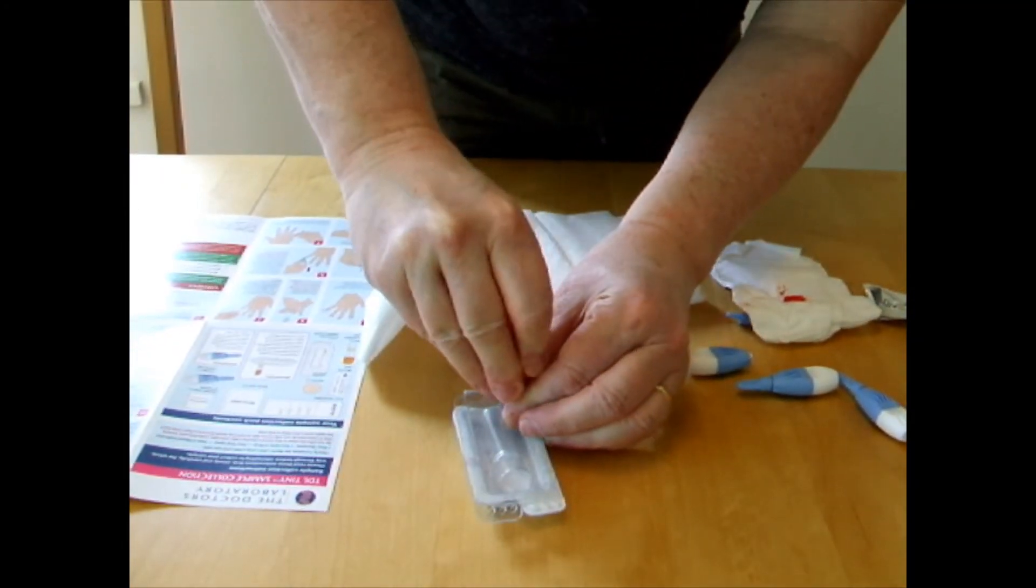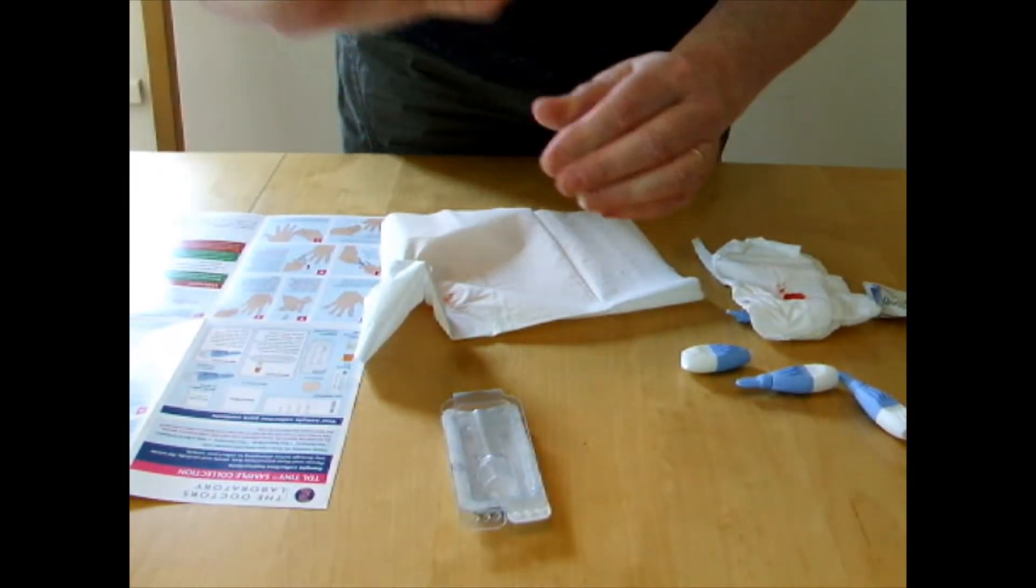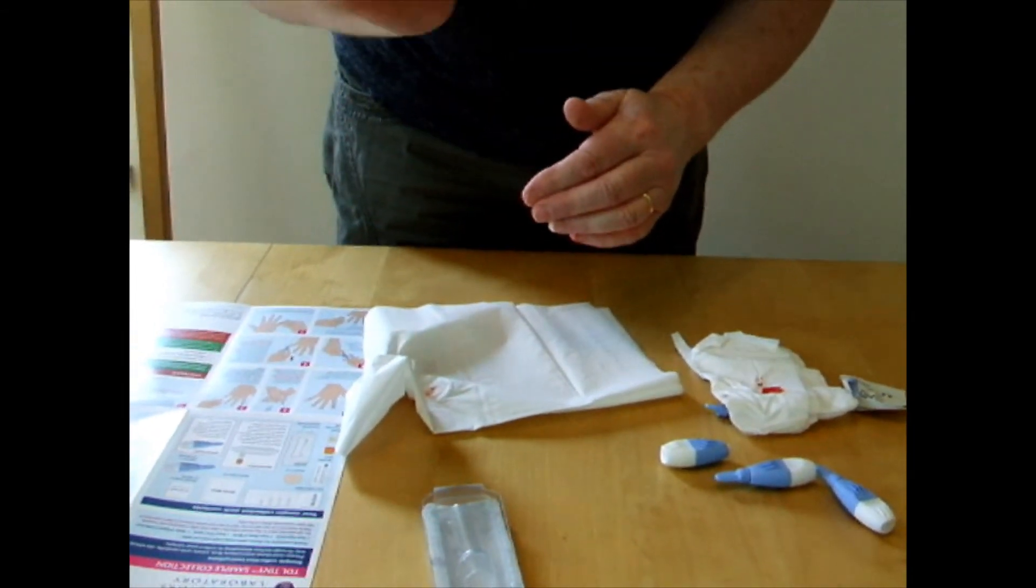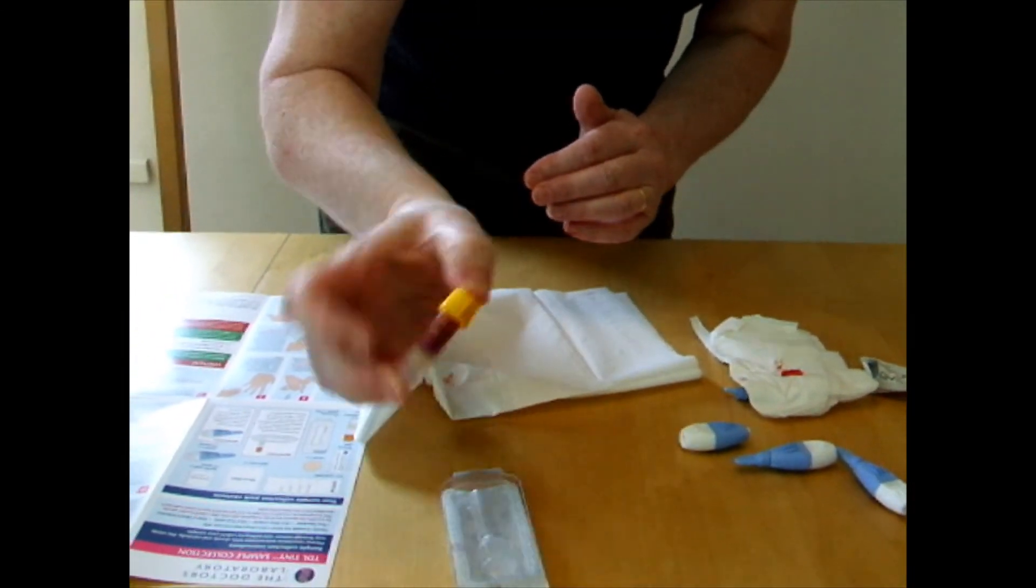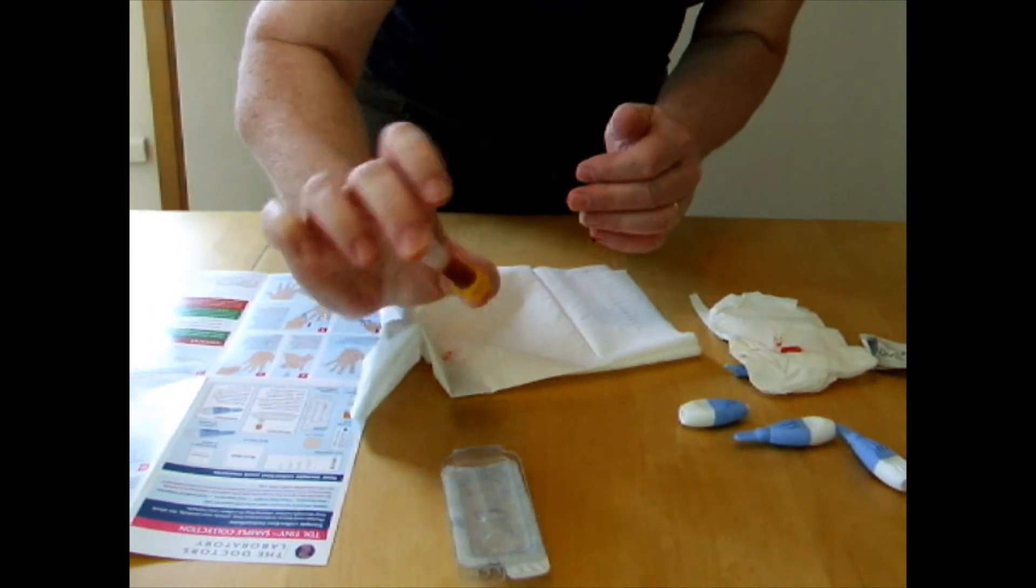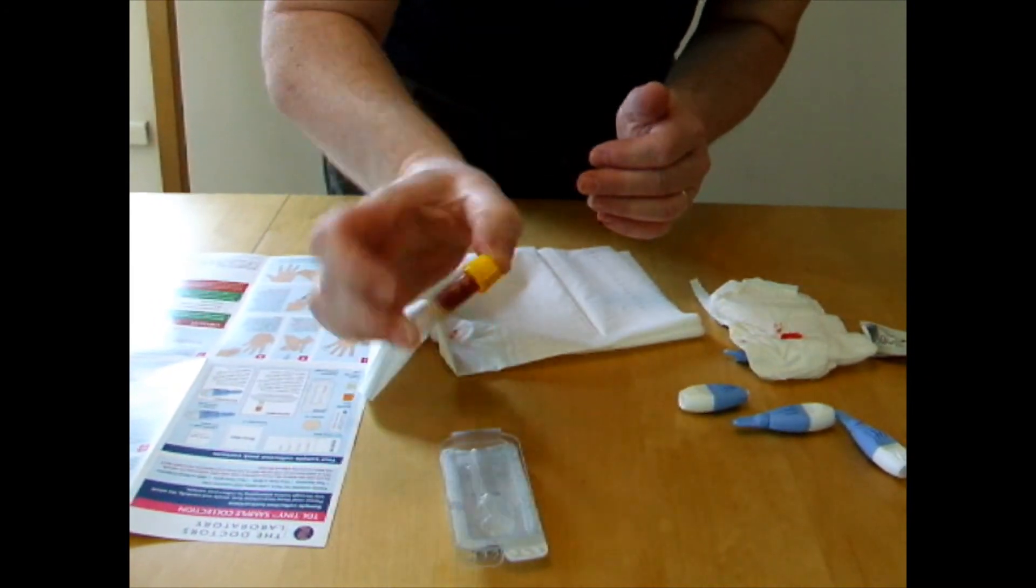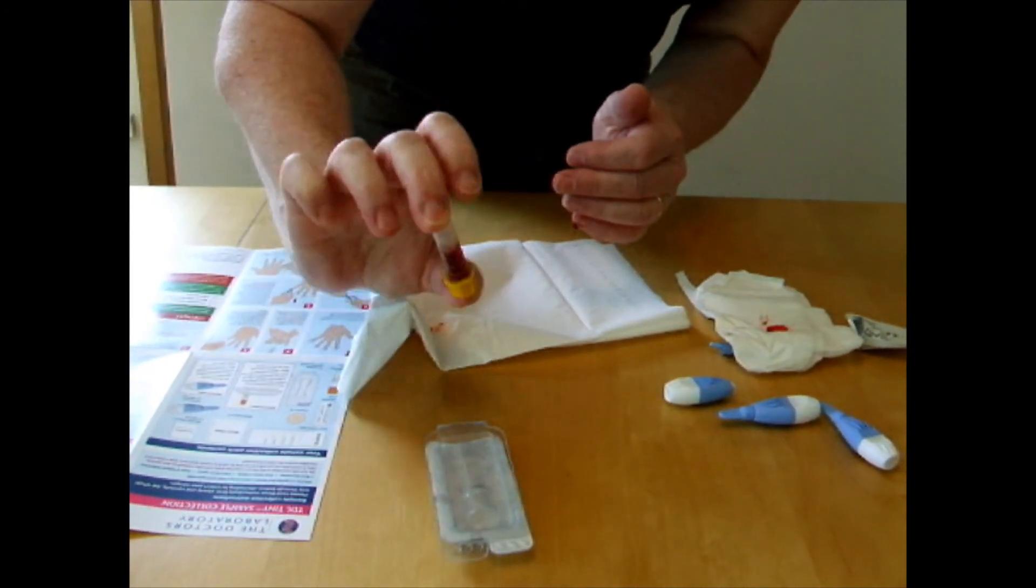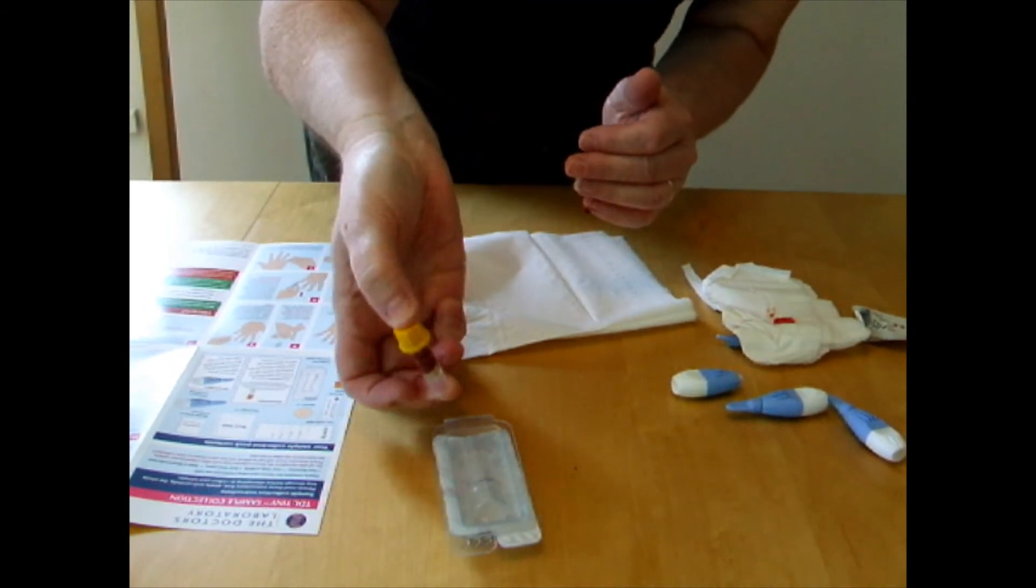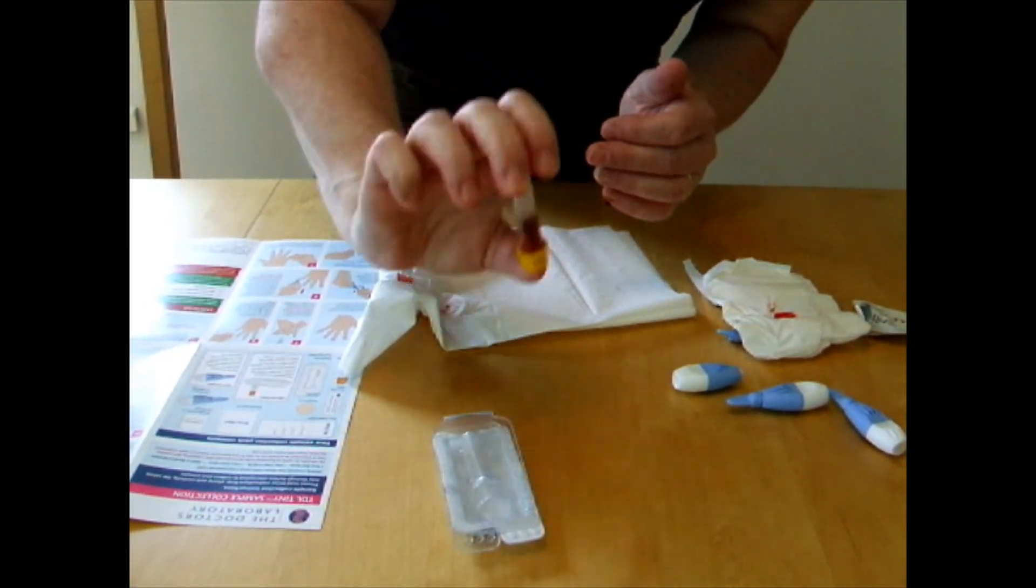And you need to put the lid onto the tube and hear it click and then invert it, turn it upside down so that it mixes. There's a chemical in the bottom so that the sample won't clot and go all solid and then they can use it in the laboratory to test.